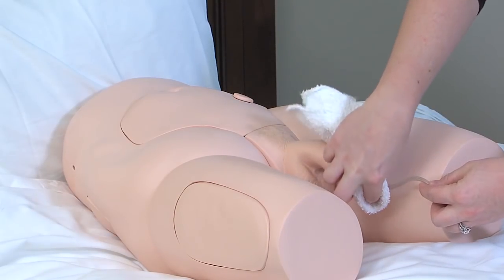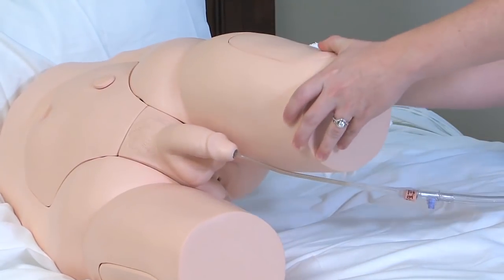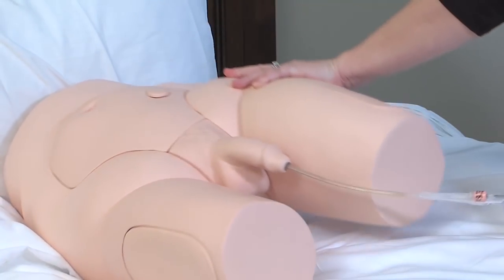It's important to keep the area around your catheter clean to prevent irritation and infection. Cleanse the area around the tip of the catheter and rectal area at least twice daily and after bowel movements. This is usually completed in the morning and evening. Clean using a washcloth, soap, and water. For males, if you are not circumcised, be sure to retract the foreskin to cleanse. Replace the foreskin when finished cleansing.